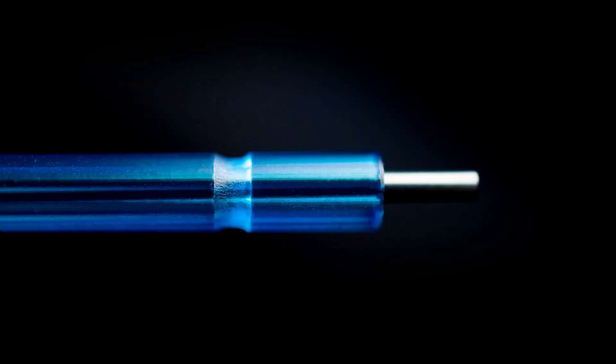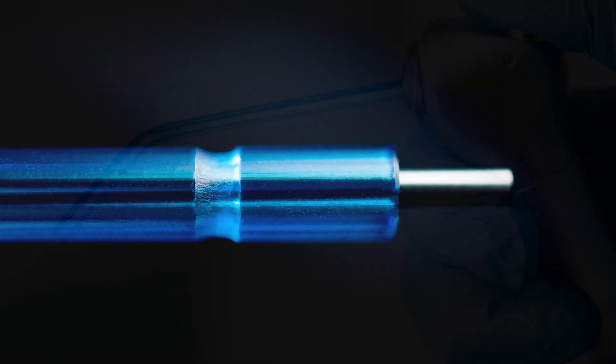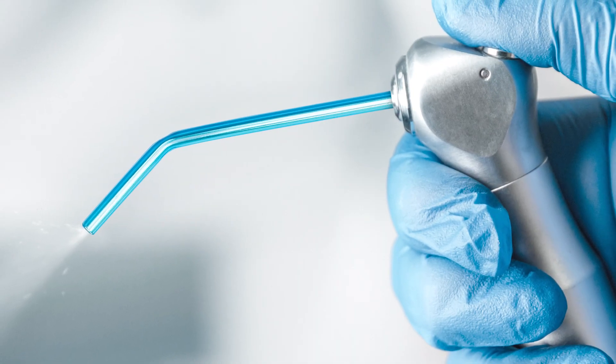Safety is paramount in dental care. That's why Rainblow tips are engineered with a notched design, compatible with air water syringe tip locking handles, preventing any kind of accidental ejection, giving you peace of mind for any procedures.